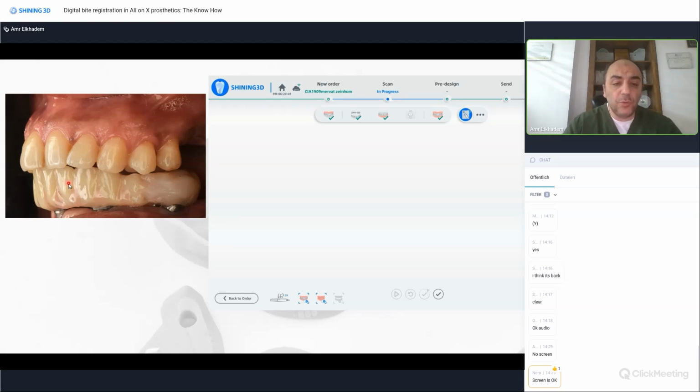If you cannot do so, after scanning the bridge inside the patient's mouth, you need to cut it off into 2 pieces with a burr. Keep 1/2 and remove the other, and then you scan the scan bodies at the one side, and then you remove the other half of the bridge and you scan the other part. So you can do it like in a fragmented scan, and then you can just join the temporary bridge again with some core material or flowable composite. But probably it goes easier than this if you scan a little bit more of the tissues behind the bridge.